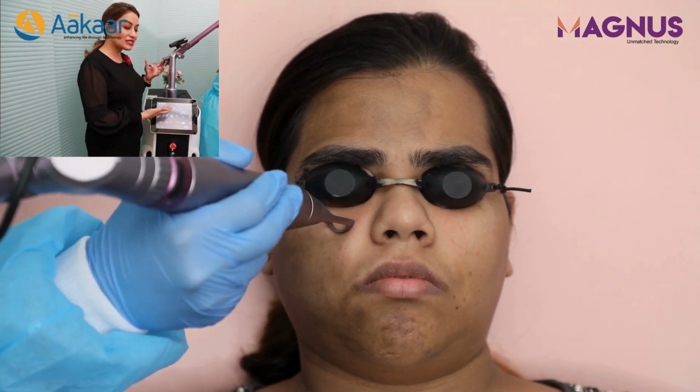So what are the indications that we can cater to with this machine? Well, this is my favorite machine because it caters to a lot of indications in my day-to-day practice. To start with, everybody is bothered about pigmentation. As Indians, we tend to pigment a lot. So it can be used safely. There is no downtime on the face. It can be used on body parts. For brides, we use it on the whole body.